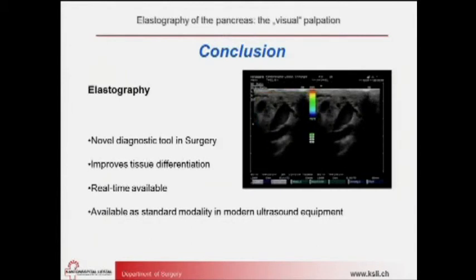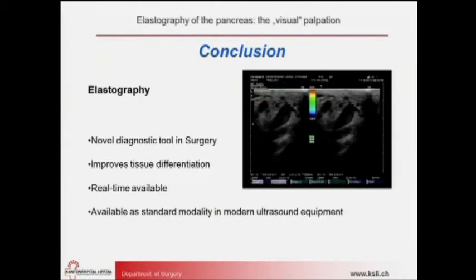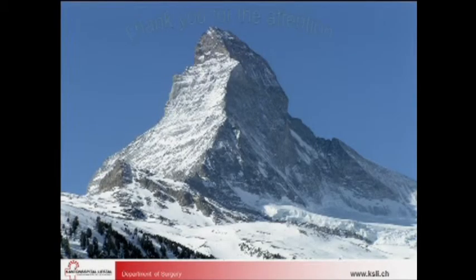In conclusion, elastography is a novel diagnostic tool in surgery, improves the tissue differentiation by the strength of the tissue, is available in real time, and is available as a standard modality in modern ultrasound equipment. And it's also a tool for gastroenterologists to perform in the endoscopic way so that you can also see tumors less than 5 millimeters. Thank you very much.